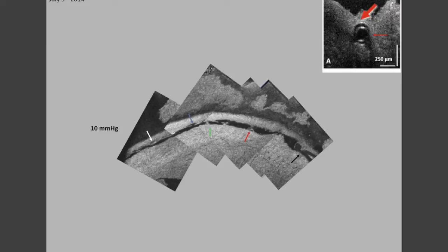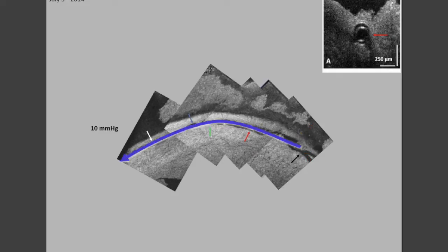A radial OCT limbal segment showing a cannula within Schlemm's canal. A meridional section of the same segment showing the cannula and its distal end, and the entire length of Schlemm's canal is visible at a 10 millimeter pressure gradient induced into Schlemm's canal. Note the entire length of the canal is dilated.